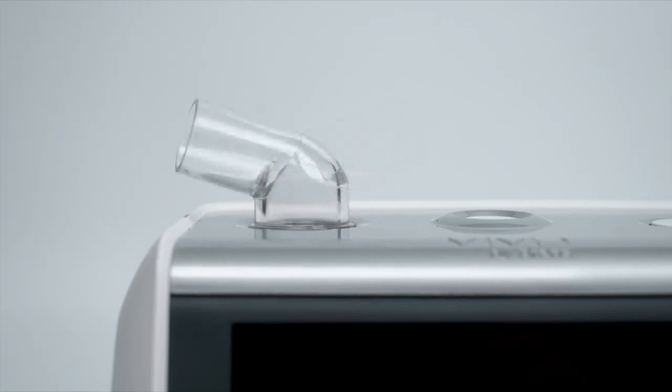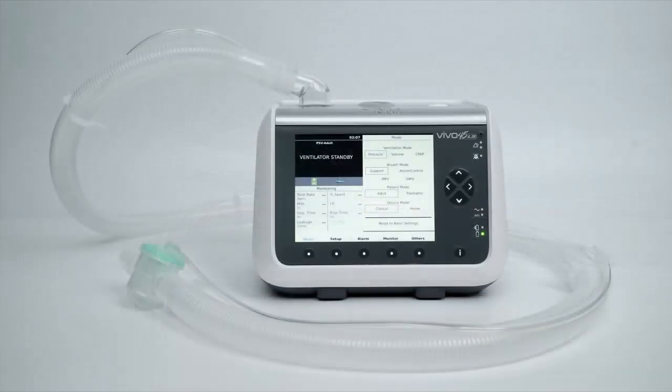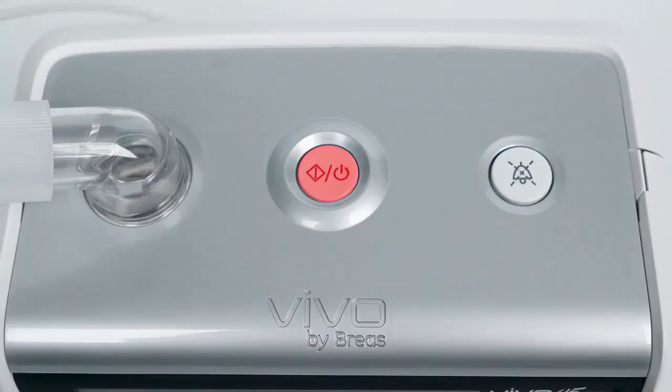This is where you will connect a single limb active exhalation valve breathing circuit or a passive single limb breathing circuit. The Vivo 45LS does not require proprietary breathing circuits. The large button in the middle of the top panel is the Start-Stop button. This button is used to start and stop ventilation treatment.